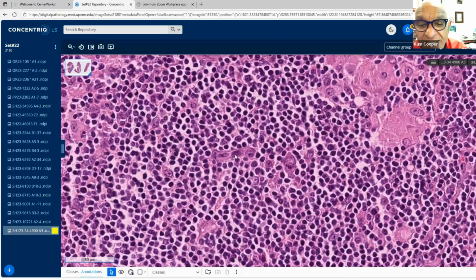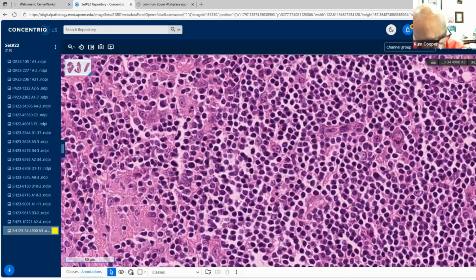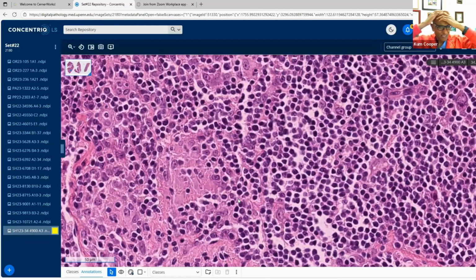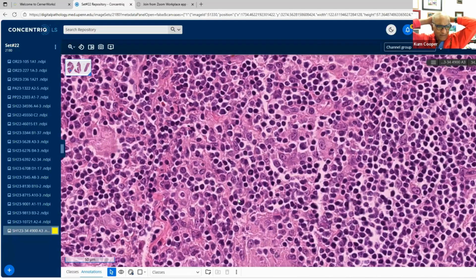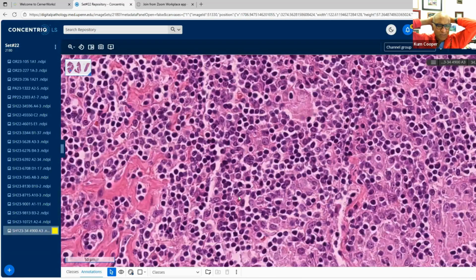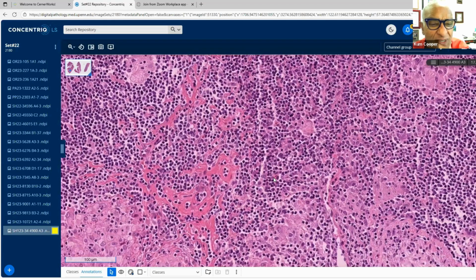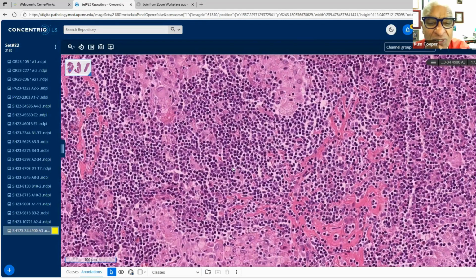There's these big cells, prominent nucleoli. And Hodgkin's markers are negative. My good friend Adam Bagg did all of the Hodgkin's markers, CD15, CD30, and those two are negative. So he brought it to me after he'd done a whole lot of stains. But there was one stain that was useful for the identification of these big cells. And it's not Hodgkin's, it's not germ cell tumors.